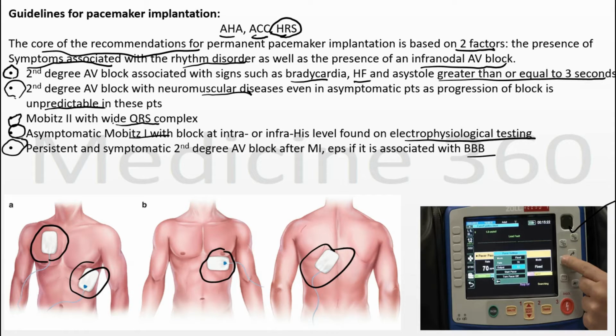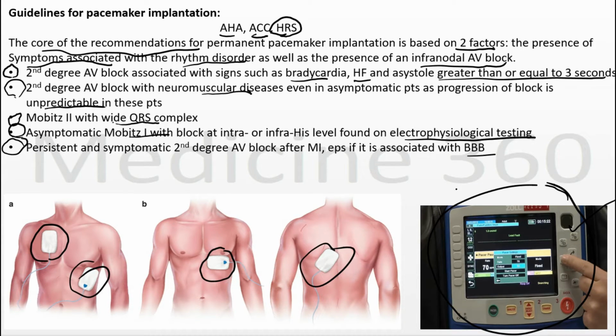Capture is actually showing the beat due to the pacemaker, and if capture is not present, we do the transvenous pacemaking. This monitor will help us to monitor the patient, either it will show capturing on the pacing and other modalities to set the rate of the patient. For example, American Heart Association guidelines give us information that we should initiate heart rate from 60, and then we move to 70 or other rate.